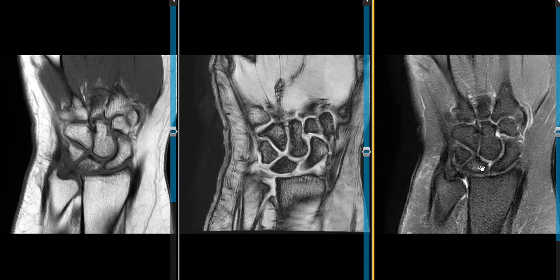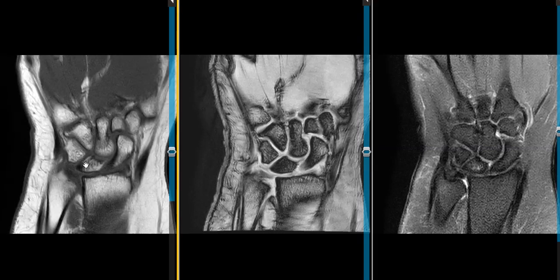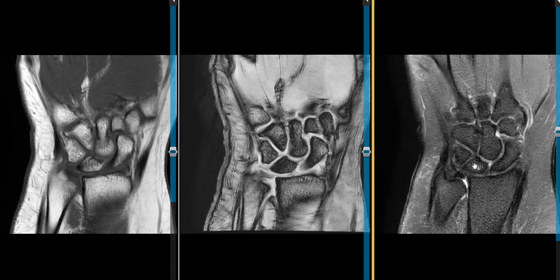In the very earliest changes it will look completely normal. Then it will go on to this — this is probably Stage 1, where you see some very mild signal changes within it. You can see this area of darkness here, which is very subtle patchy marrow edema. So this is just an early stage of the avascular necrosis. It's good to recognize right now so they can immobilize and hopefully the patient can go on to heal. As it progresses to the next stage, the lunate bone will become diffusely abnormal — it can look really dark on T1.